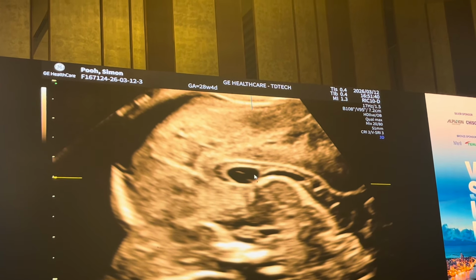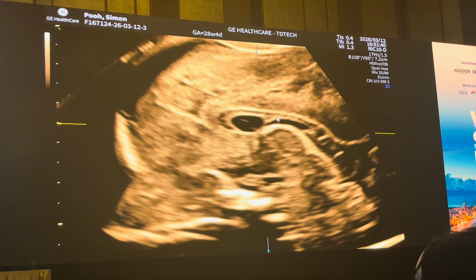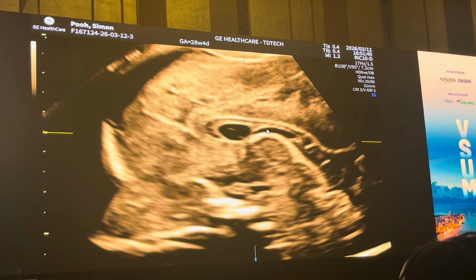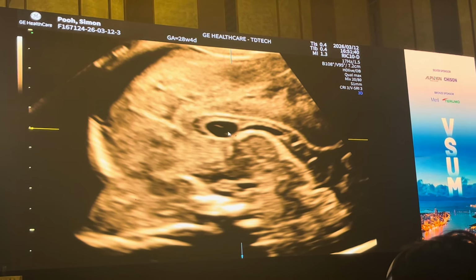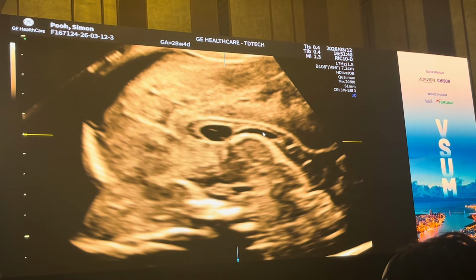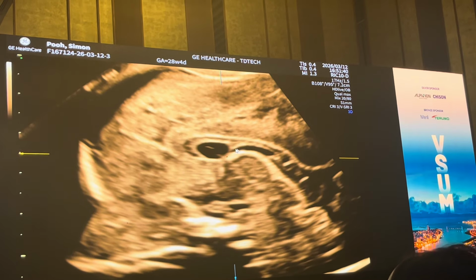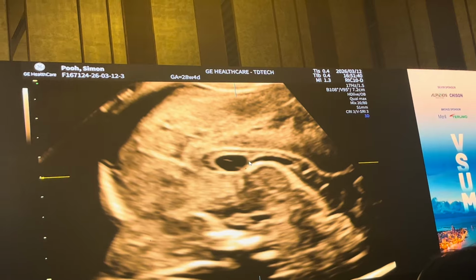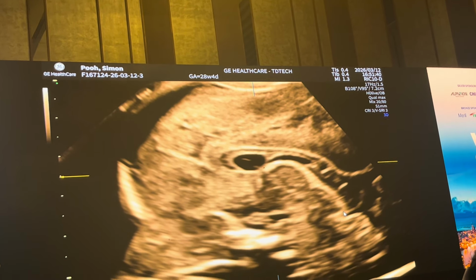Yeah, I think sometimes we see this membrane like the septum inside of it, and that is divided into the septum and the vergae. Yeah, right. And then I think that this is the septum here, but it is not so important. Okay. Significant. And can you point out the tela choroidea and why that's important?